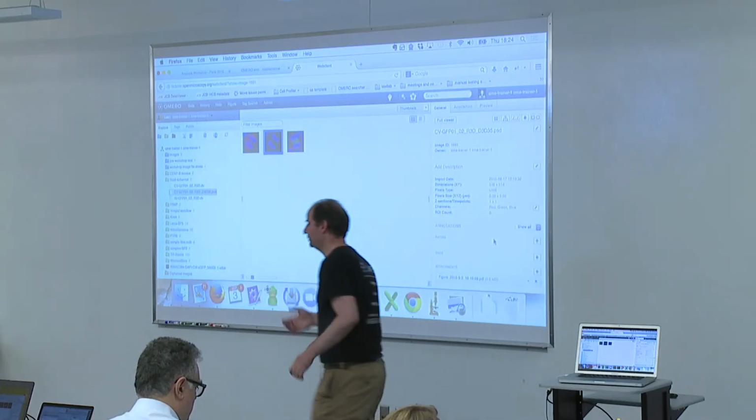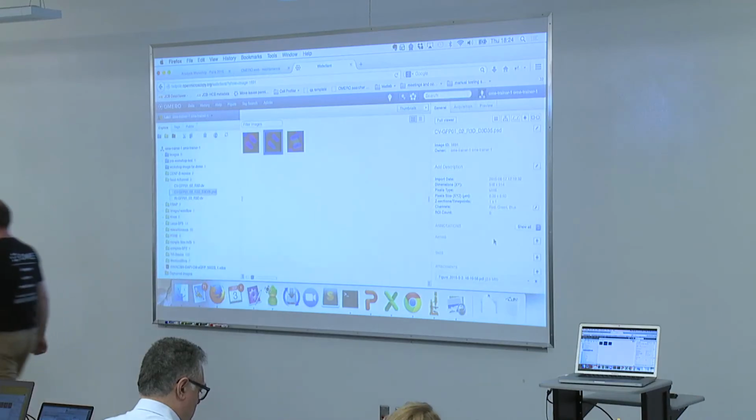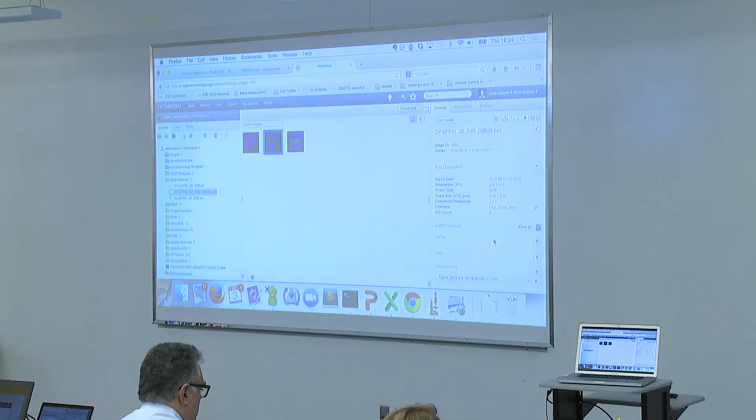Yeah. You had a question. I think you're mobile now. Thank you. The scalability, magnitude: what kind of experience do you have in terms of data size, number of images, size, management, that kind of thing?